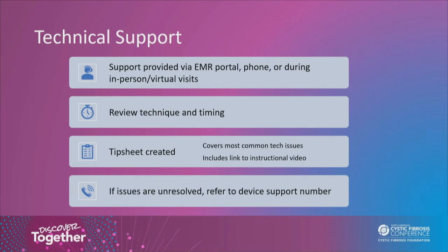A tip sheet was created that covers the most common issues. Some of these include Bluetooth and location services issues, updating the app, battery changes, among other things. The tip sheet also includes a link to an instructional video. Many have found the instructional video to be very helpful. If the issues are still unresolved, we do refer our patients to a device support number, and this has also been successful in resolving issues.